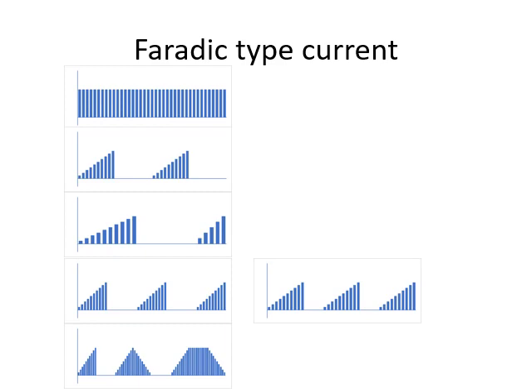The second one, there is a progressive increase in the intensity of subsequent pulses followed by a sudden drop, rest interval, and again a second burst of these surged pulses. So there is an intensity modulation. In the third one, you can see that surge time is longer, so the intensity increases to the peak slowly, but the duration of burst is longer, whereas in the subsequent burst there is a relatively rapid rise in the intensity and the duration of pulse is shorter.